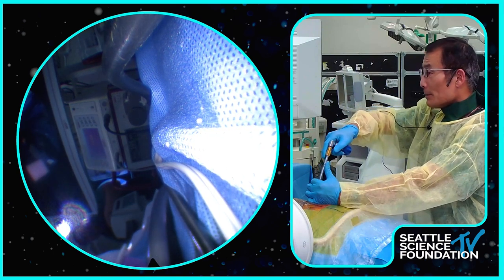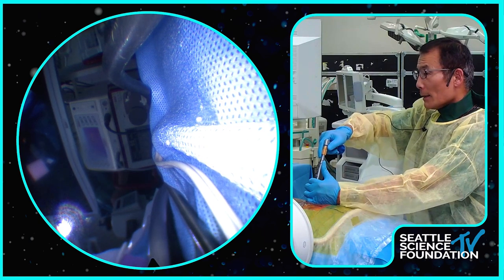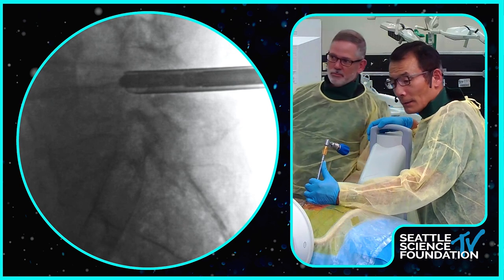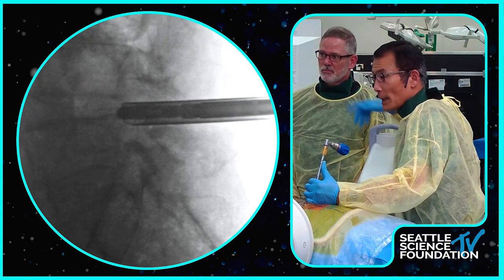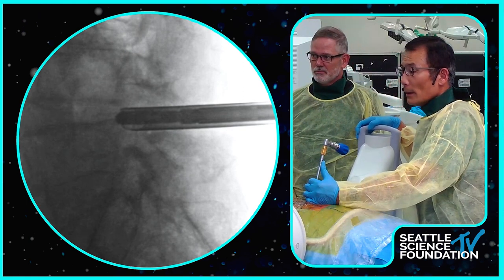can you take a lateral? Yeah, see, take another lateral. It's not a perfect lateral. Let me see. Just whack toward the head a little bit. Yeah, just a little bit. That's good. So, that's good.